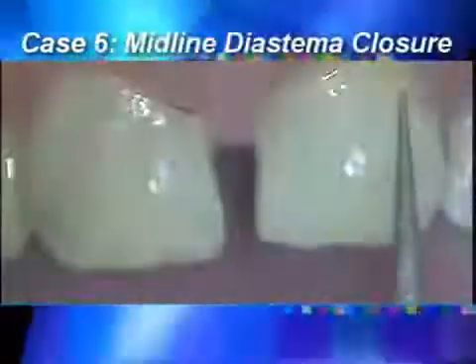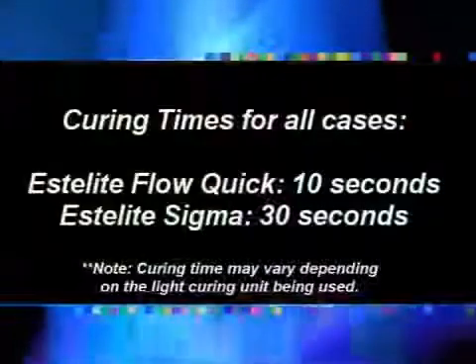This video will demonstrate 6 clinical cases. The first, a micropreparation involving a Class 1. The second, a deeper preparation, also involving a Class 1. The third case is a Class 2, using a sectional matrix. The fourth case is a Class 3. The fifth case is a Class 5 restoration, and the sixth, a midline diastema closure.